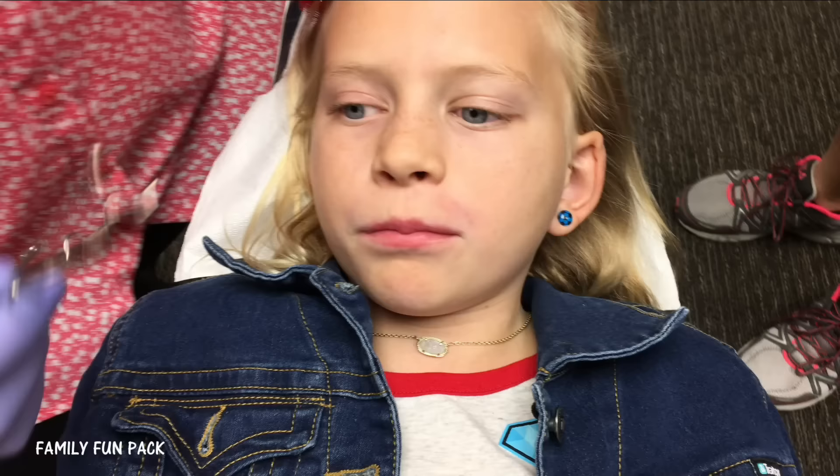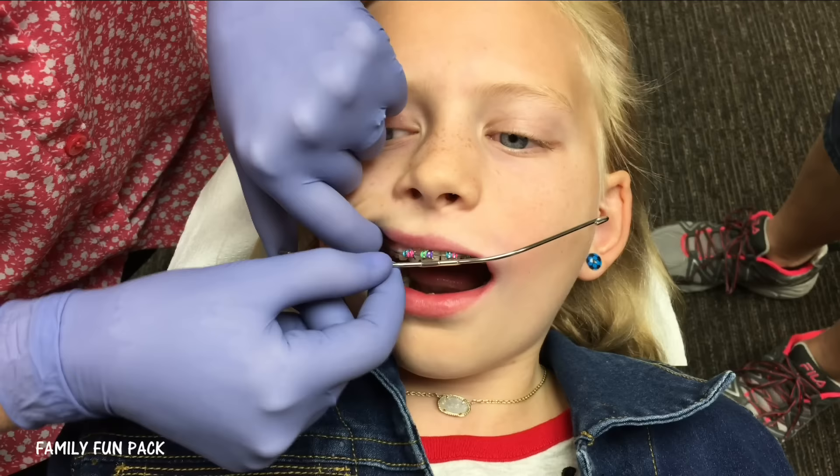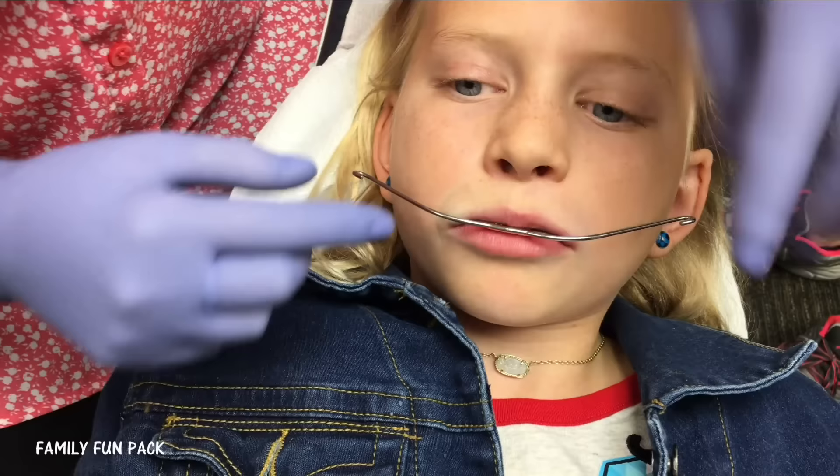We're going to let the glue set and then Miss Melanie is going to take off the extra glue and then show you how to do the turns. So we're going to place it in — pick up the left side, find that little tube and slide it in until it stops. Now the head ear is made a little bit wide and that's on purpose. So on this side, you have to take your thumb and kind of pinch it in. You pinch it in, line it up with that tube, and slide it in until it stops. And that's how that looks, just like that.